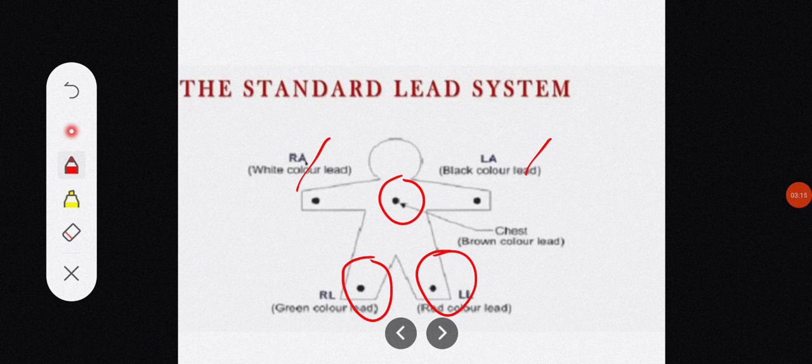These electrodes are used for recording the ECG signal. The waveform of this ECG signal is very dependent on the placement of electrodes. Some segments of the ECG signal may almost disappear for certain electrode placements, whereas others may show up clearly on the recording. For this reason, in a normal electrocardiographic examination, the electrocardiogram is recorded from a number of different leads, usually 12, to ensure that no important detail of the waveform is missed.